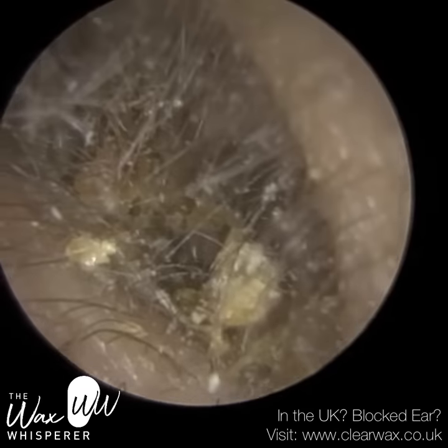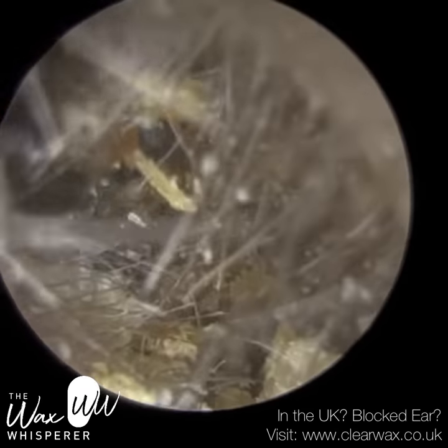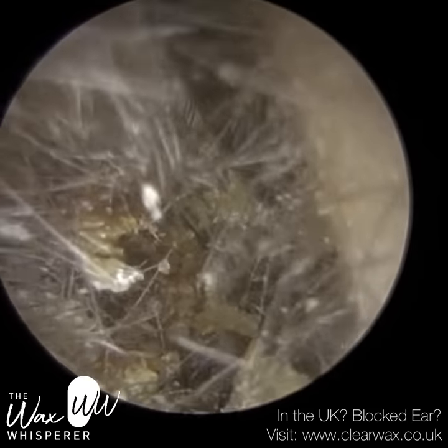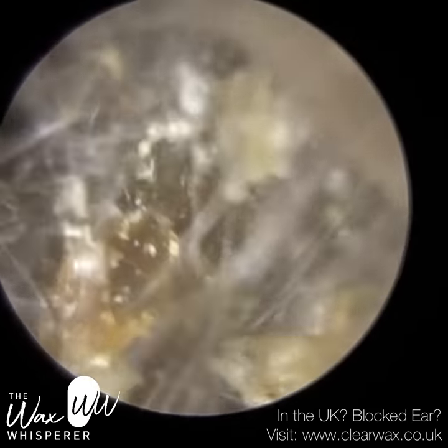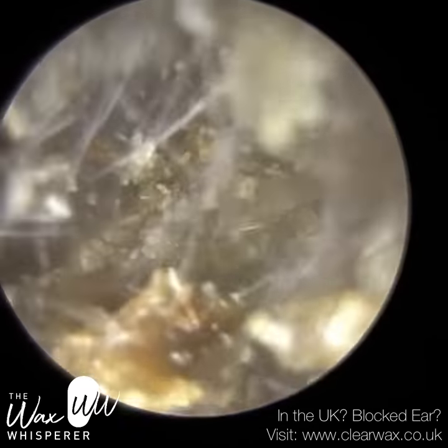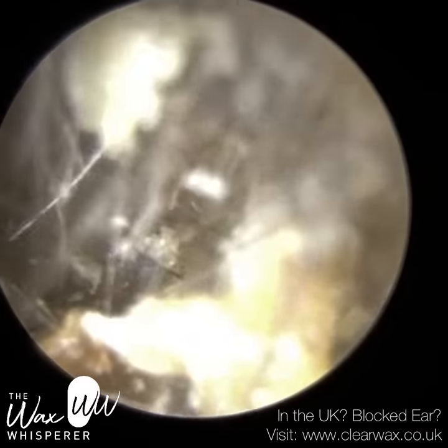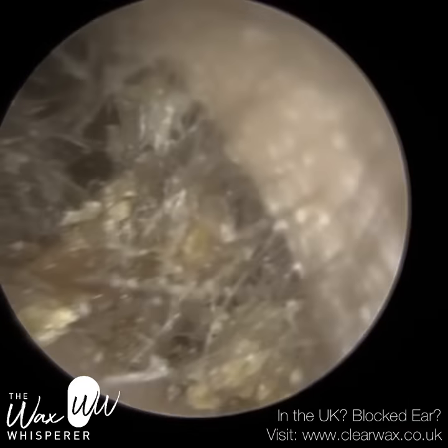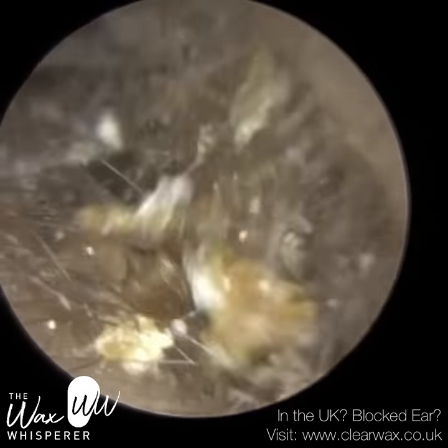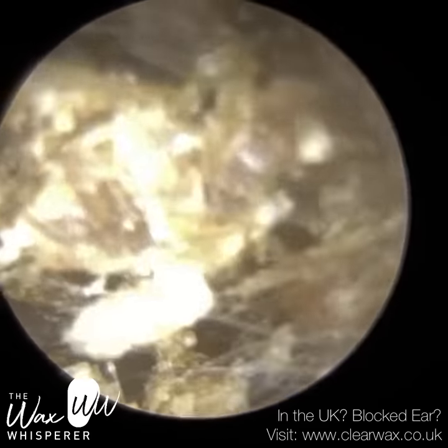Particularly at the entrance of this patient's ear, you can see there's quite a few hairs. But these hairs were found all the way through the wax — it almost looked like a haystack, the wax a bit deeper in. When we removed the remaining pieces of ear wax off the eardrum in both ears, there was so much matted hair in the ear wax. It really did resemble the look of a haystack.